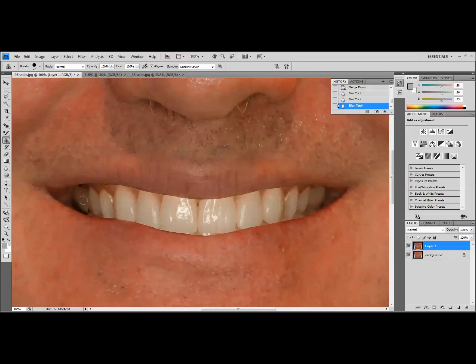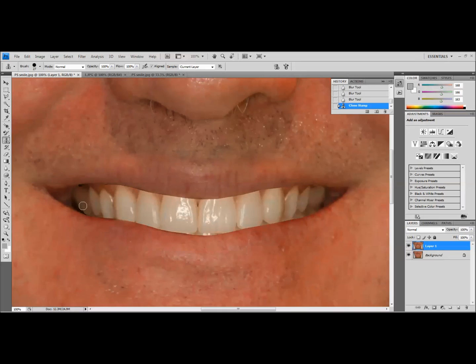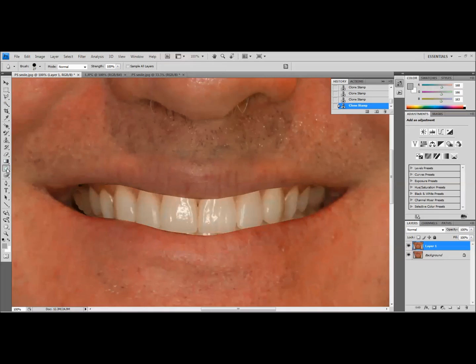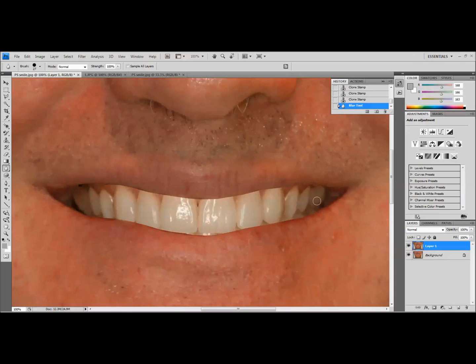It will blur in here some and it really depends on how fancy you want to get with this. If I want to use the clone stamp tool where this looks like it's not so clean, we could press alt and then right or left click with what's in the crosshairs and that's going to make this a little sampler, a color sampler. And we can come back and blur that again. So I'm not going to go overboard with this. Remember we're really zoomed in and we're talking about the minutiae at this point.